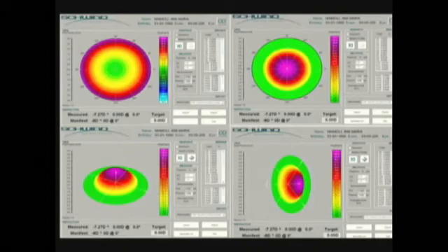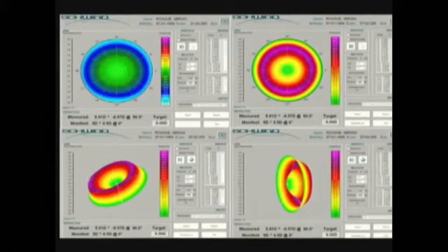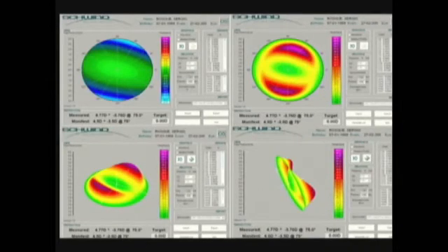This is the typical myopic correction. Let's say this is theoretical for 7 diopters of myopia. See the deep central ablation. This is a patient with a high astigmatism, patient with hyperopia, peripheral ablation, it's a relative central steepening, compound astigmatism, wavefront guided.